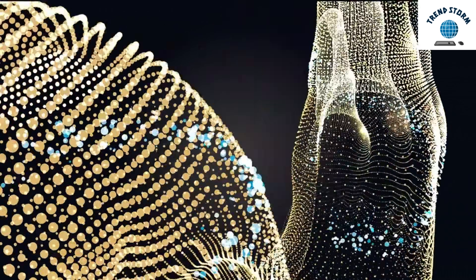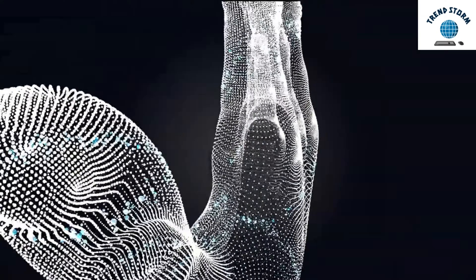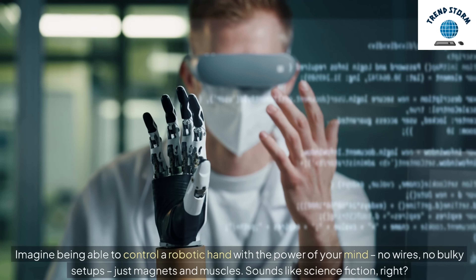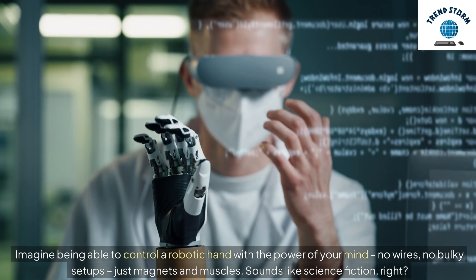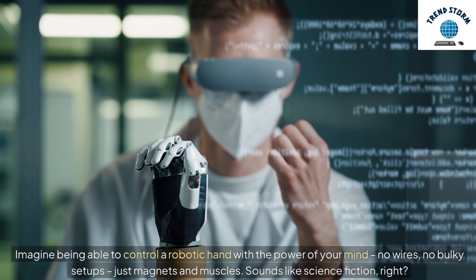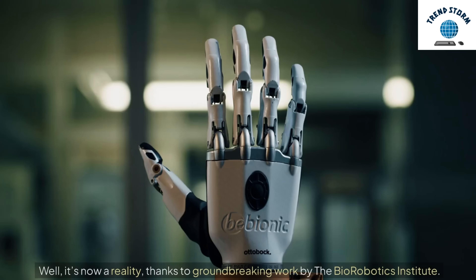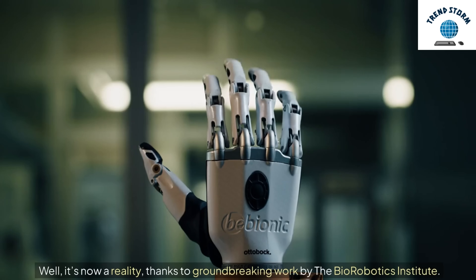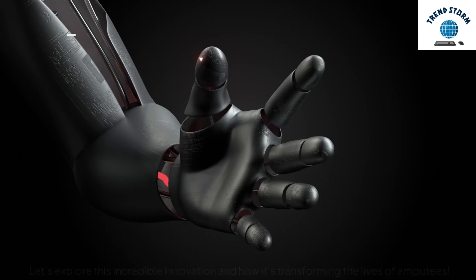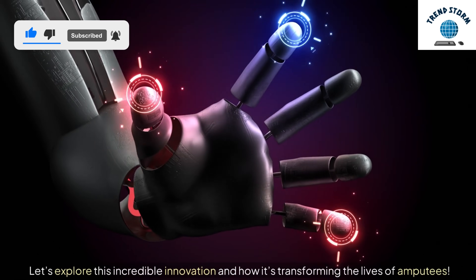Hey everyone, today we're diving into a breakthrough that could change the future of prosthetics forever. Imagine being able to control a robotic hand with the power of your mind — no wires, no bulky setups, just magnets and muscles. Sounds like science fiction, right? Well, it's now a reality, thanks to groundbreaking work by the Biorobotics Institute. Let's explore this incredible innovation and how it's transforming the lives of amputees.